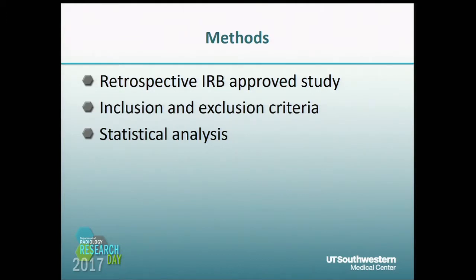So this is a retrospective IRB-approved study of patients who were diagnosed with femoroacetabular impingement who had undergone 3D CT of the pelvis. Myself and another radiologist went through all of these images and measured the alpha angles as well as the volumetric measurements. And then we compared to see how reliable we are in doing these measurements.